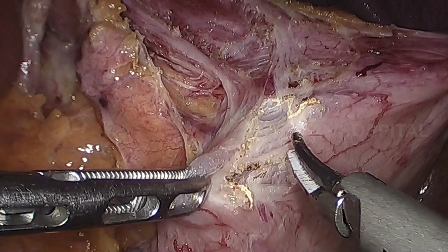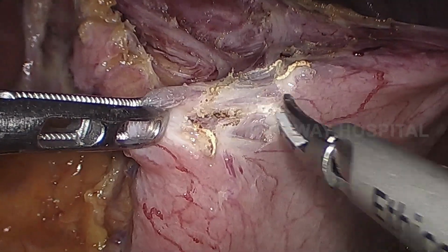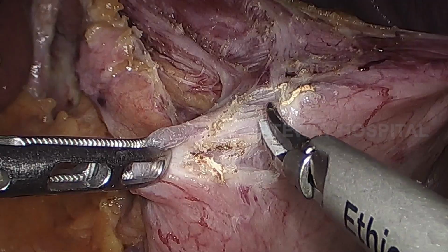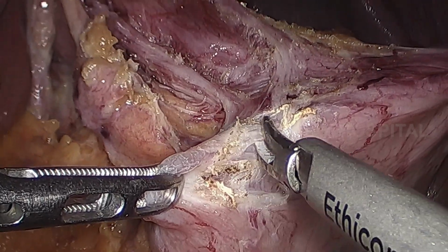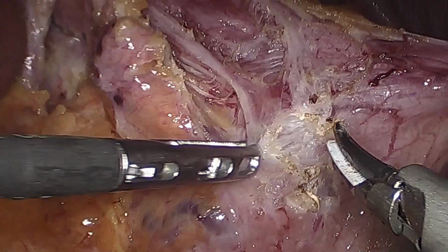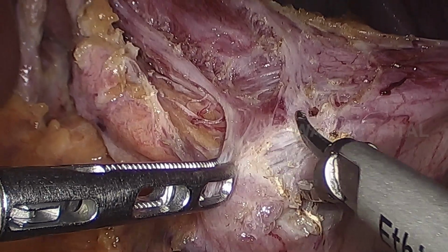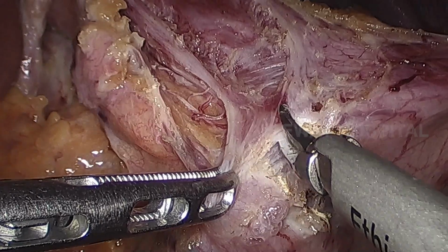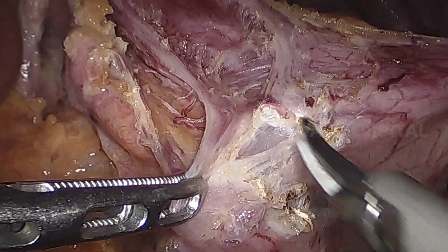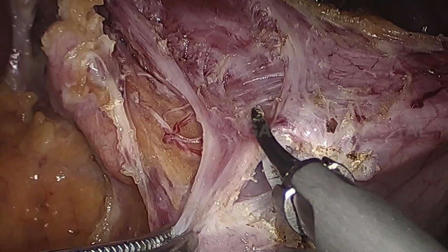After completion of the esophageal myotomy, now we have come to the gastric side myotomy. We make a muscular incision about 2 to 2.5 centimeters below the esophagogastric junction, and gradually we deepen the division until we reach the submucosal plane.